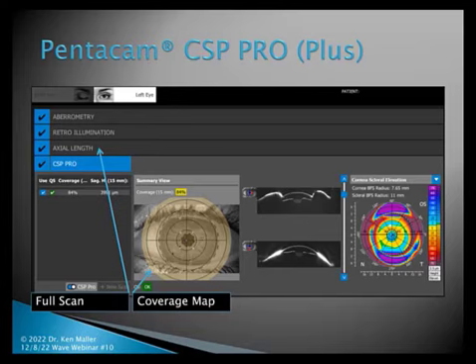You'll notice that on the black and white photograph behind the overlay, it looks as though the lids are in the way. That's not displaying the actual capture that was done. It's just overlaying on one of the images of the eye how much capture we actually obtained. So don't think the coverage is saying that I caught the data off the lids.